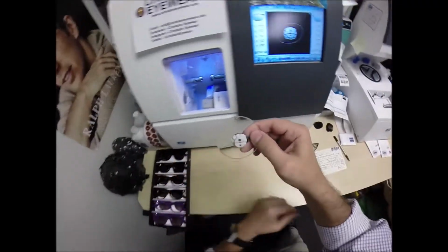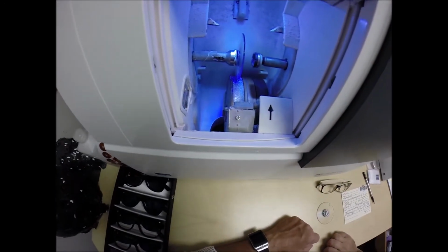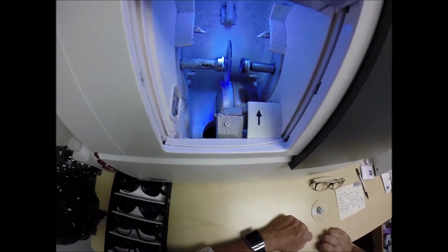Now, the magnet's going to do its job a second time. It's going to attach itself to another magnet there in the chuck, or as I call it, the Charles, because I just don't know this machine well enough to call it Chuck.